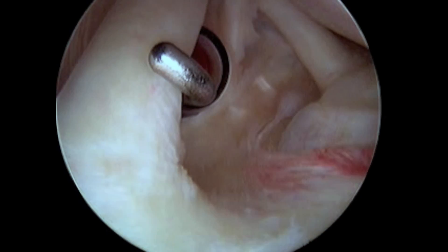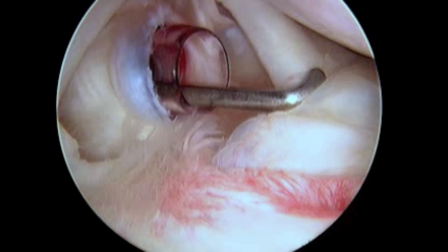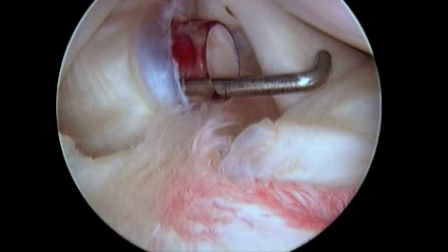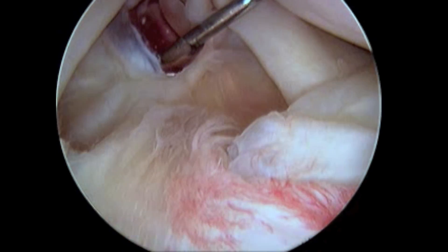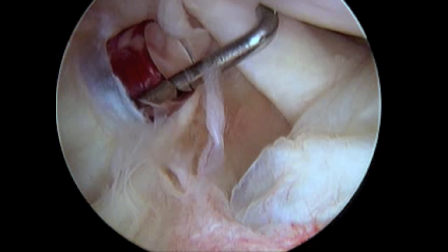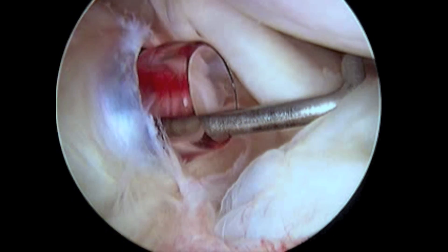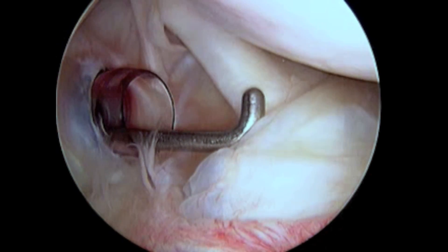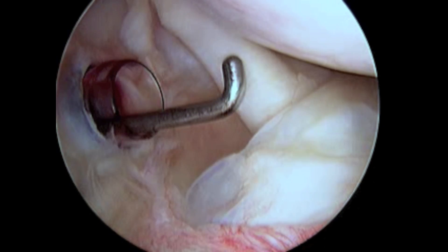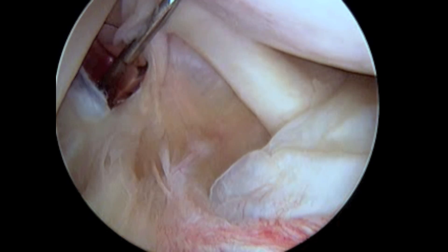The next structure probed is the subscapularis tendon, one of the four rotator cuff tendons. The subscapularis originates from the scapula; the fibers pass from medial to lateral and insert on the lesser tuberosity of the proximal humerus.